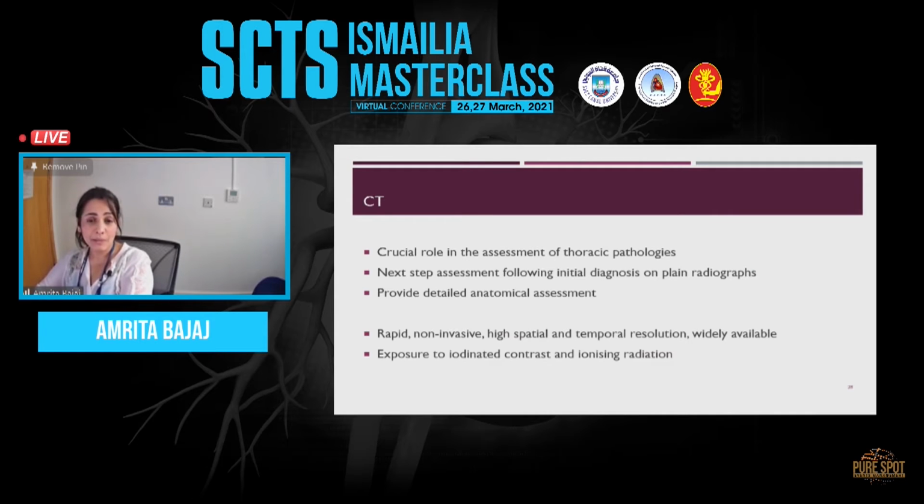So that brings us to the next modality, which is CT. Again, widely available. It's got a high spatial and temporal resolution. Of course, it uses a lot more iodinated contrast and is almost invariably used as the next step in the staging process.